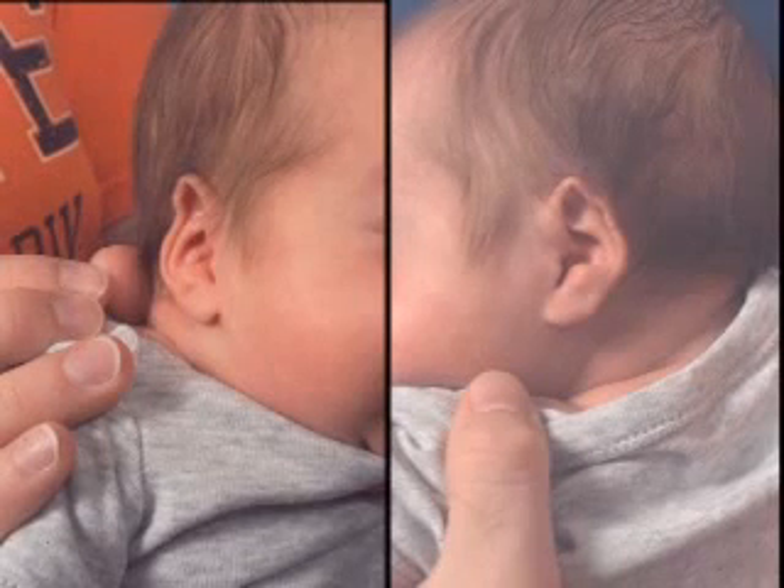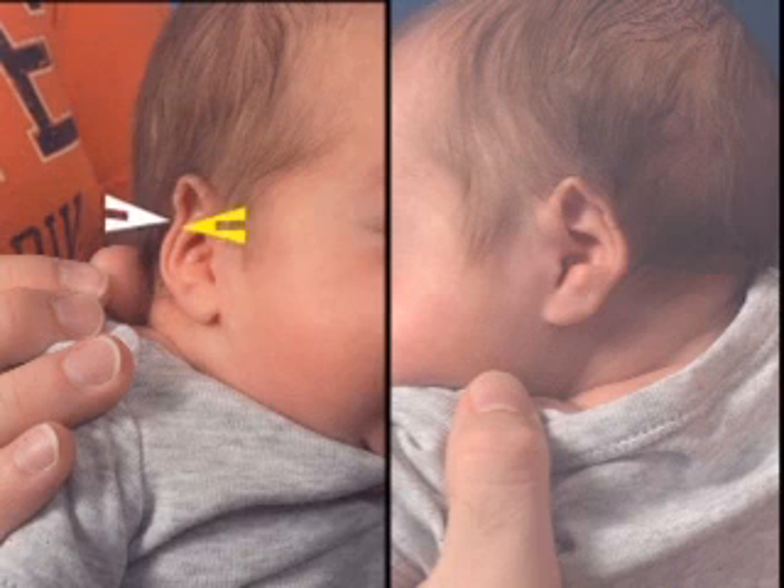Helical compression is a deformation involving the scapha and helical rim. There is essentially a collapse in the cartilaginous portion of the scapha, allowing the helical rim to rest in an unnatural position against the anti-helix.